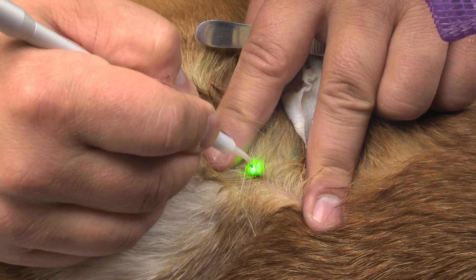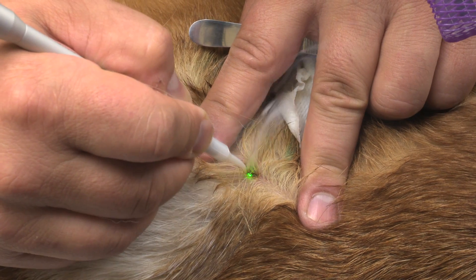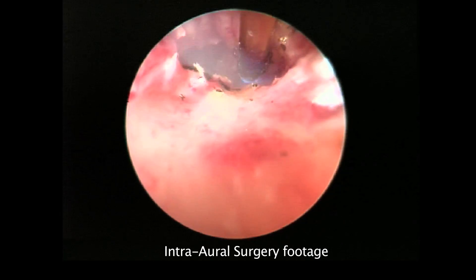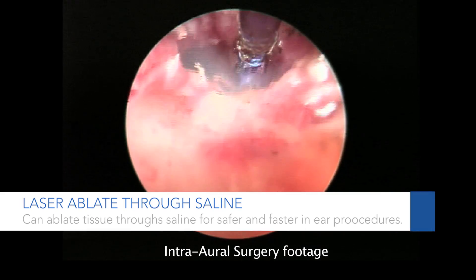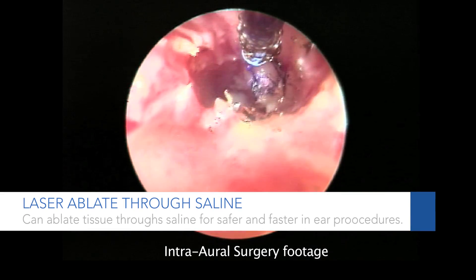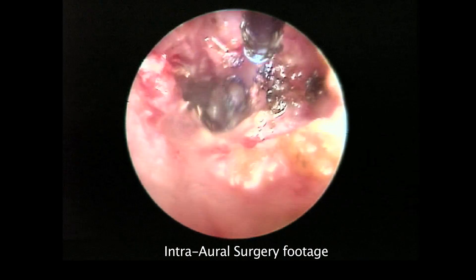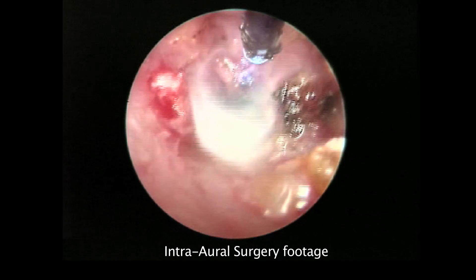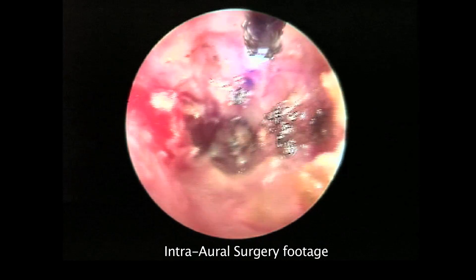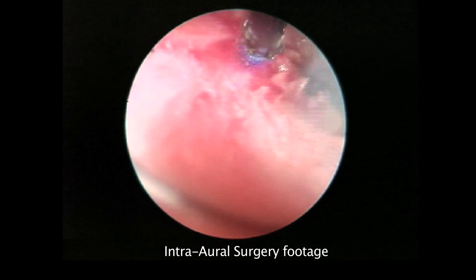The benefit of the diode over the CO2 is that we can actually work in multiple media. We do a lot of surgery in the ear, and within the ear we can actually instill saline and still use the diode through the saline. This keeps the heat down in the ear canal and minimizes any burn in that very sensitive, moist tissue.